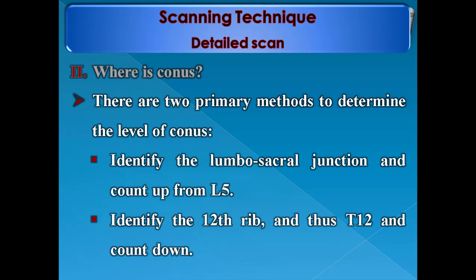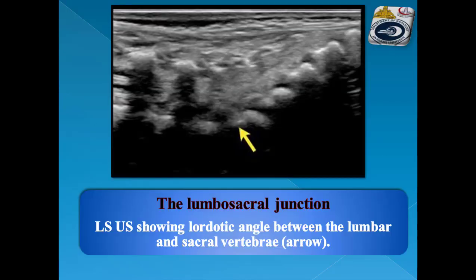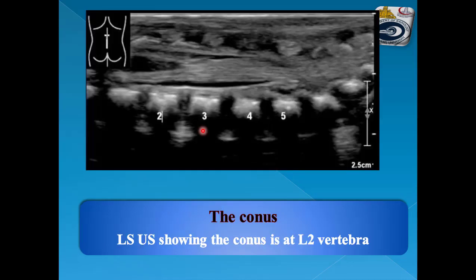To identify the lumbosacral junction: on the LS image of the ultrasound, look for the lordotic angle between the lumbar and sacral vertebrae. This is the arrow — this is L5 and this is the lumbosacral junction. Another example: the angle between the lumbar vertebra and the sacral vertebra is used to count. Here the conus is at L2 vertebra.